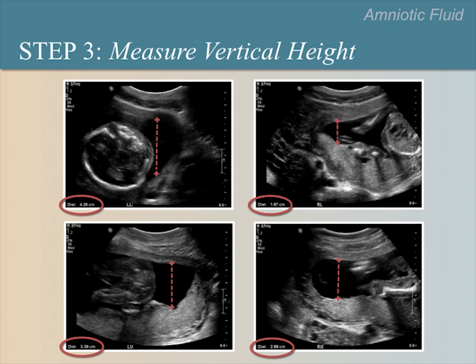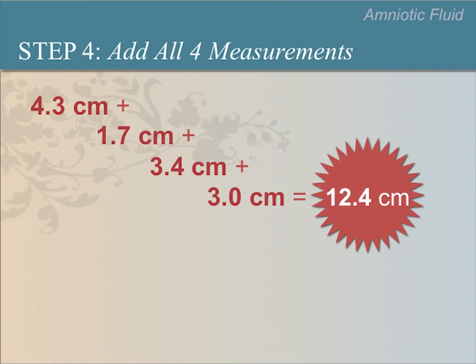Step 3 is to measure the vertical height of each pocket. Note the calipers in the image and the vertical direction — straight up and down — of the measurements. Finally, add all four measurements together to determine the amniotic fluid index. A normal AFI falls between 5 to 24 centimeters, and the AFI in this patient is normal.